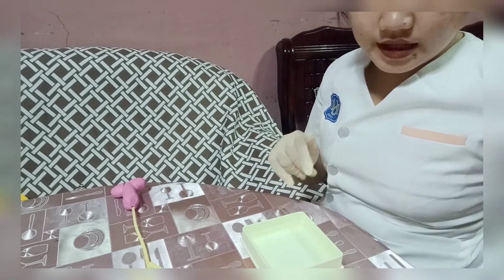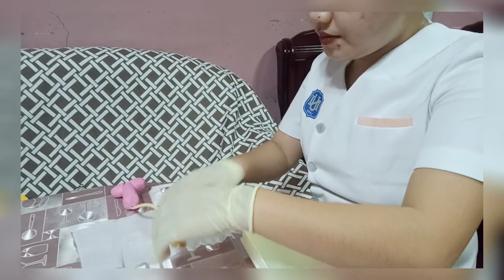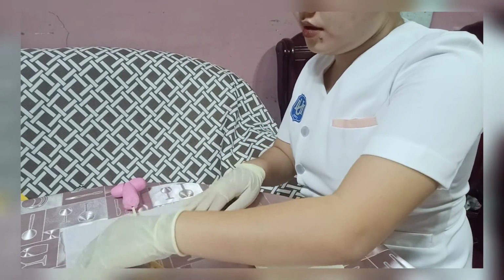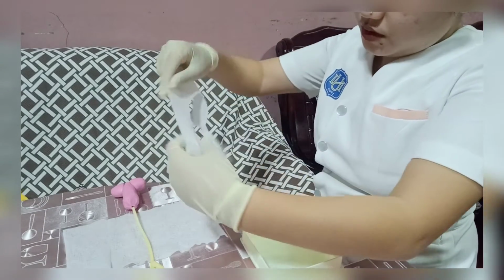For our male patient, it is the same procedure. We have to provide a drape pad and expose the area where we could start the procedure.